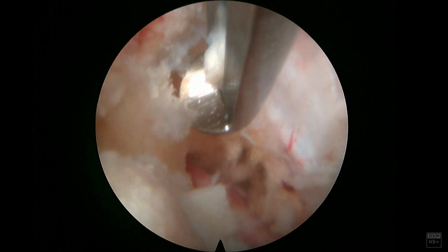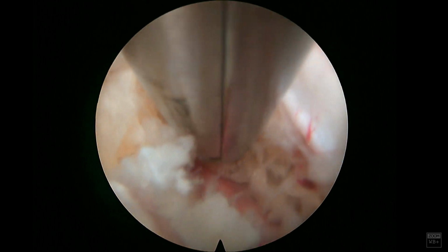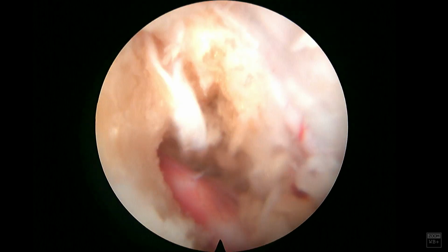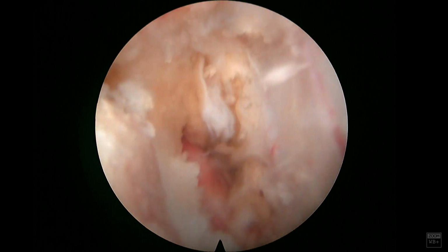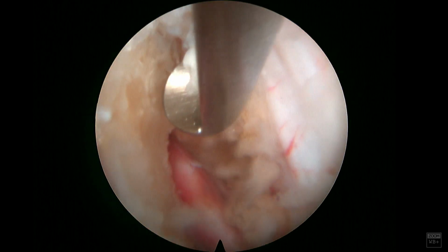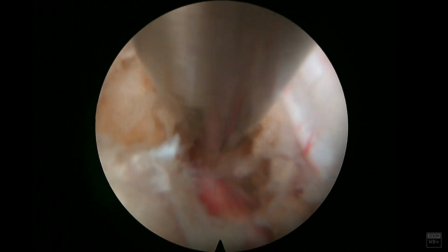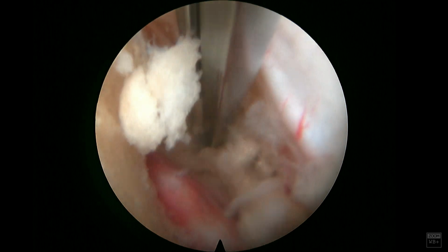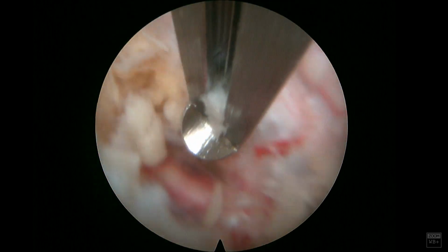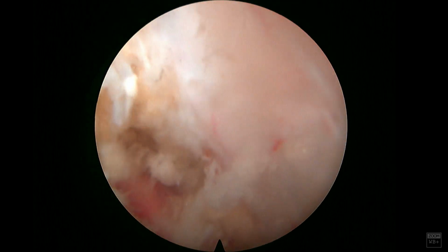single dermatome radiculopathy. So you can see here, this is important as I remove these last pieces of bone here along the lateral recess. I know that the traversing nerve root is starting to take its exiting course at the L5 pedicle down below, and so I'm not going to want to take too much more bone during my decompression in order to prevent destabilization of that segment. So you can see here that traversing nerve root is entirely decompressed.